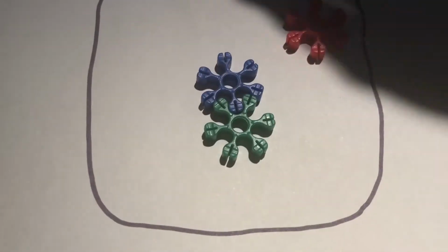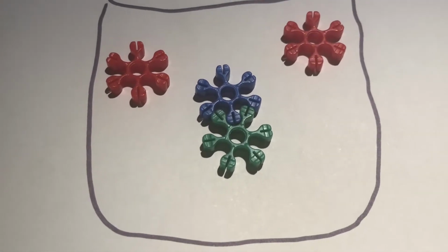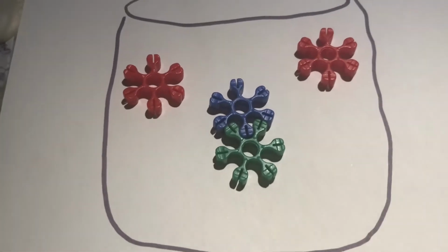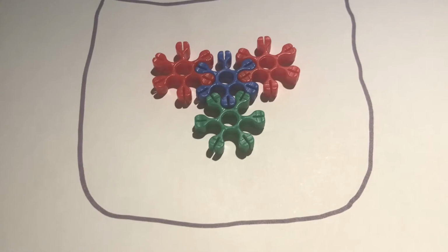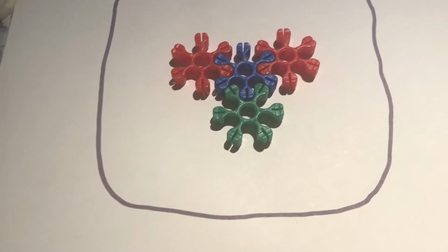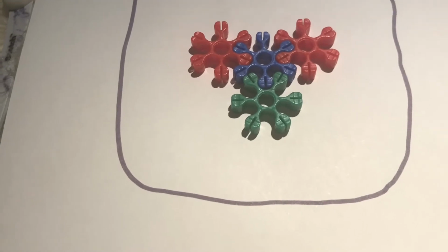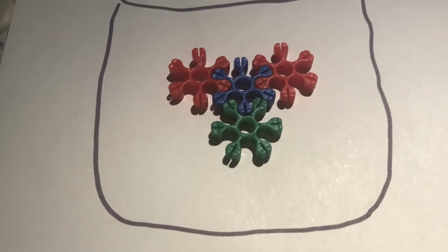Our specific situation is a type of ELISA known as indirect ELISA. We must add secondary antibodies. These secondary antibodies will be derived from another animal, and they are also called polyclonal. We use secondary antibodies because they amplify the signal of the antigen.